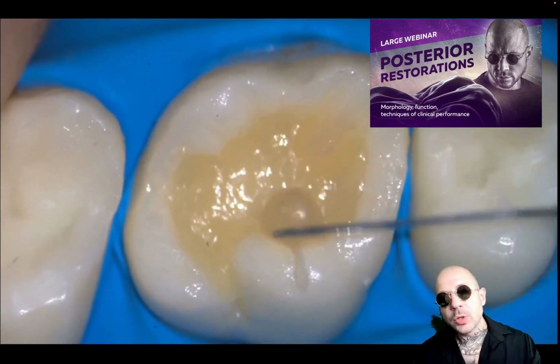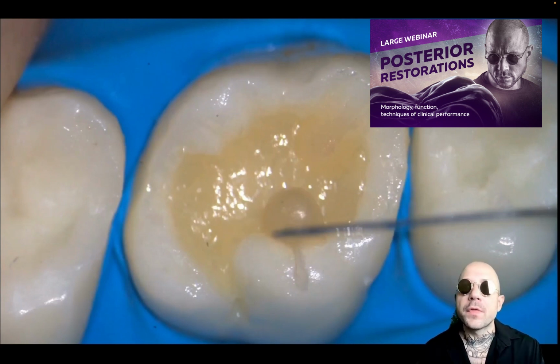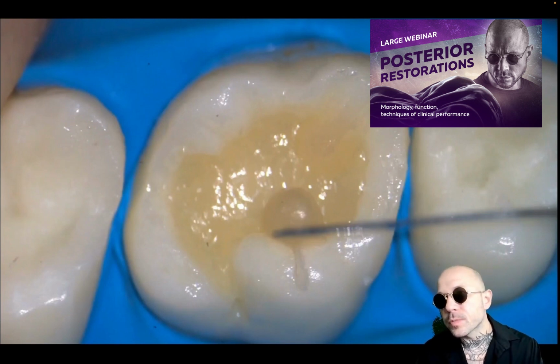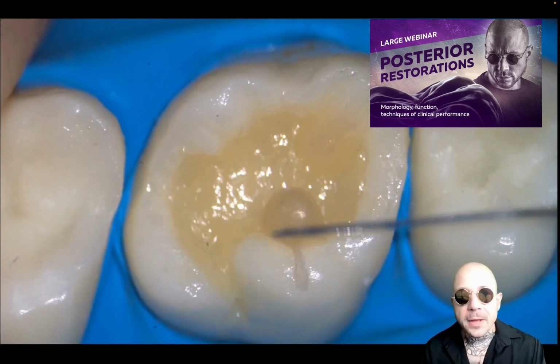And I told you on the pictures of the presentation before, when we think together how to manage the free space of our cavity, planning a future morphology.